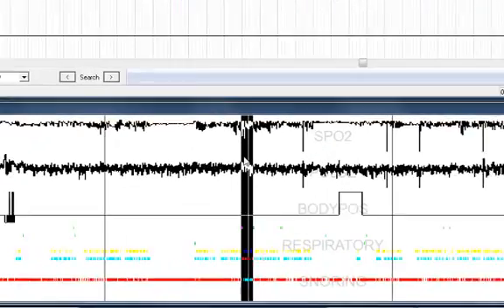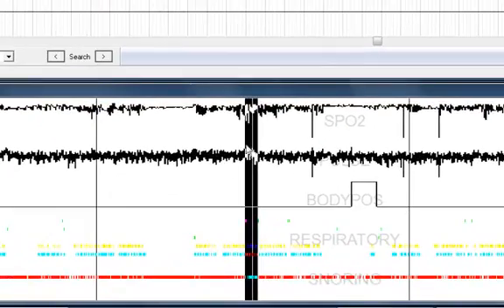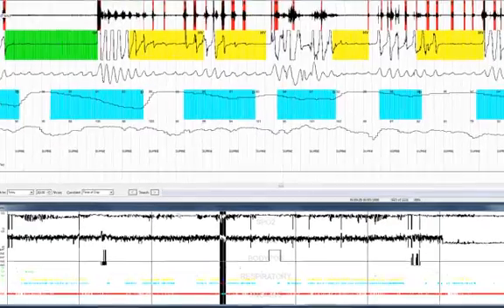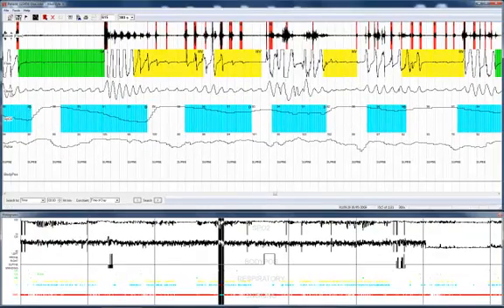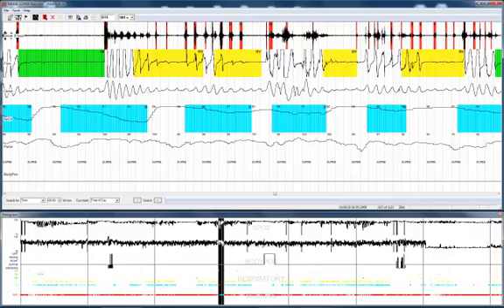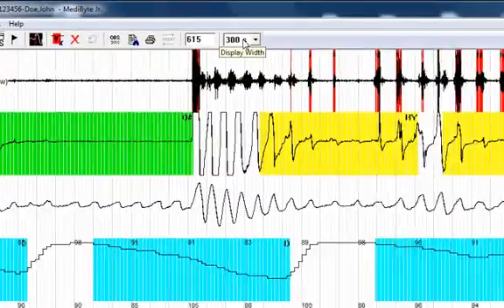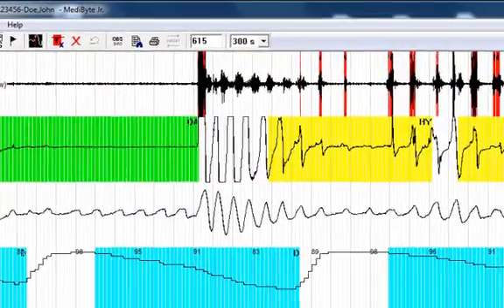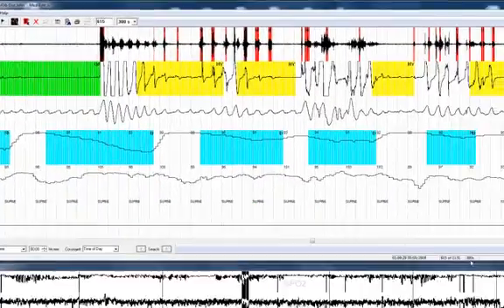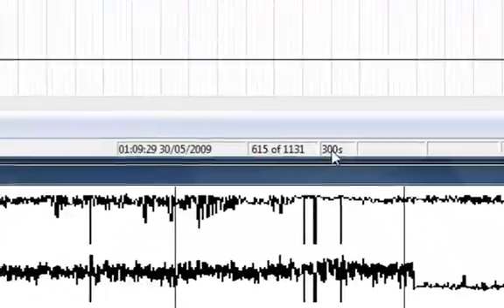This thick black band corresponds to the strip chart display above it. So this left margin here corresponds to the beginning of this strip chart display. The right side of this thick black band corresponds to the right edge of the strip chart display. We know the width of the strip chart display because it's shown here. The display was at 300 seconds or five minutes. It's also shown here at the bottom of the screen.